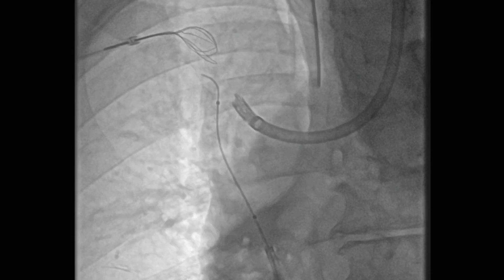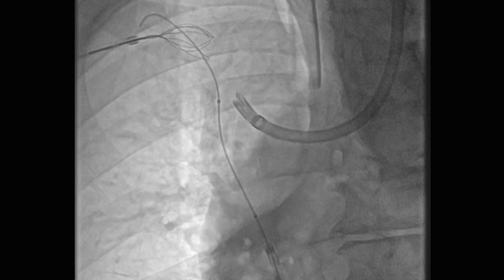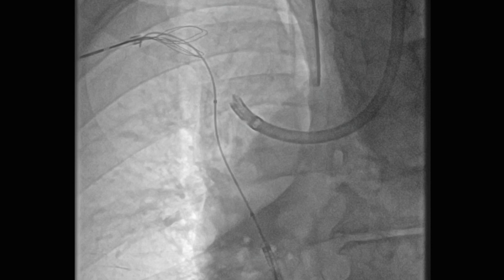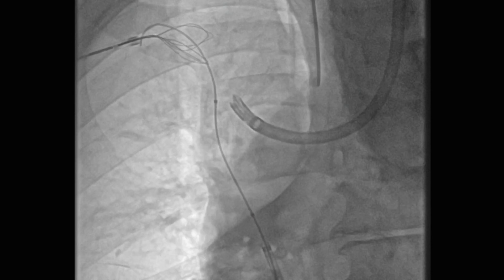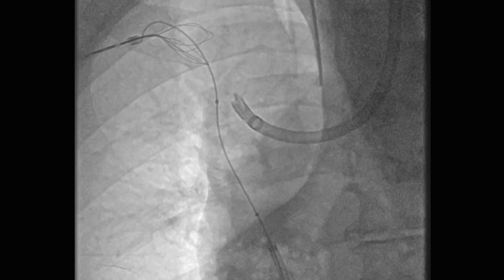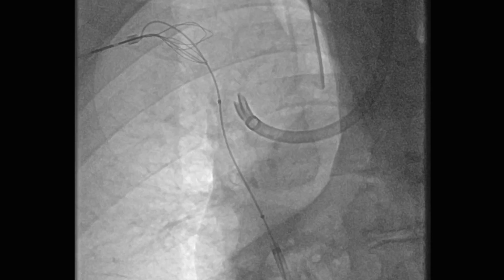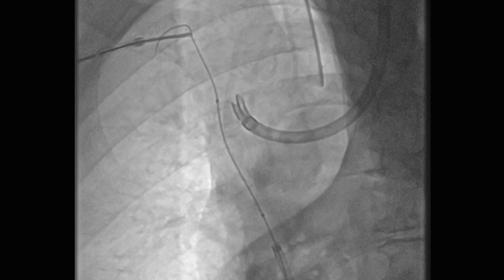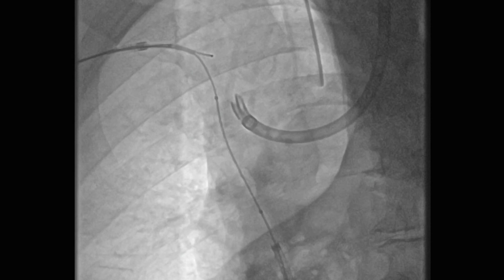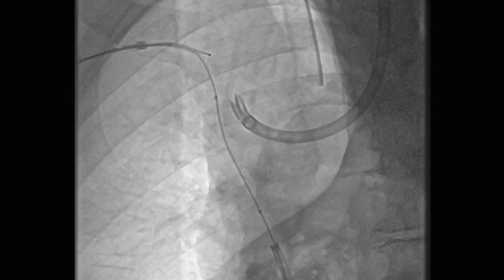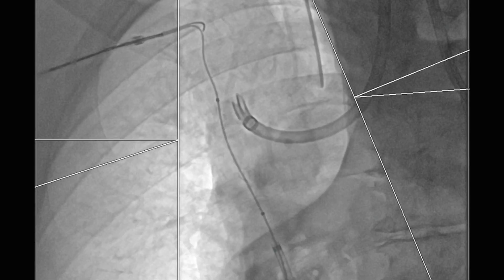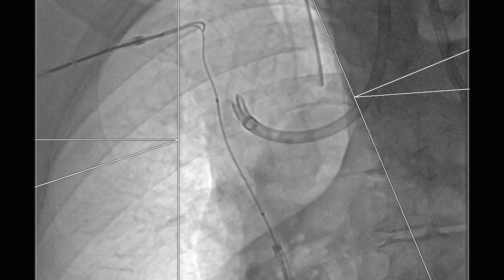Here you can see a venogram taken from both access sites, which showed an occluded superior vena cava, as well as a left IJ TDC that ends up in the right brachiocephalic vein and was causing him problems with dialysis.